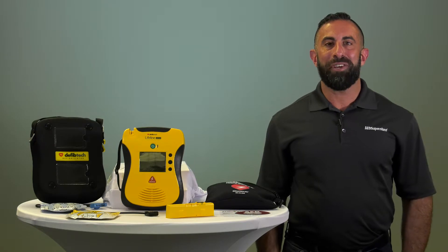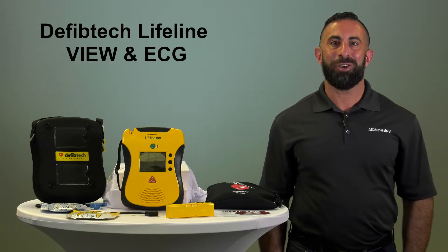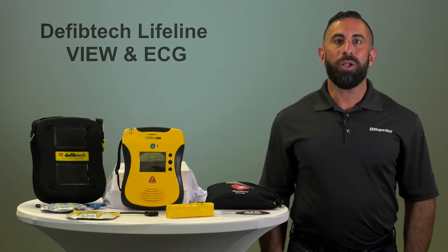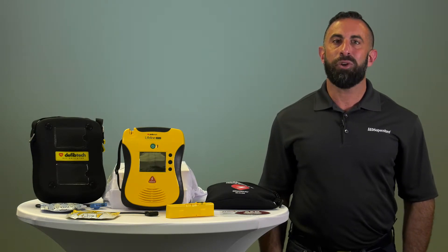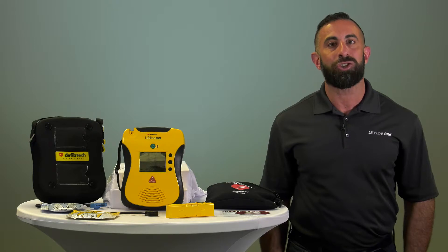Today we're going to talk about the features and benefits of the DefibTech View AED. While all other AEDs tell you what to do in an emergency, the Lifeline View is the first and only one that shows you.